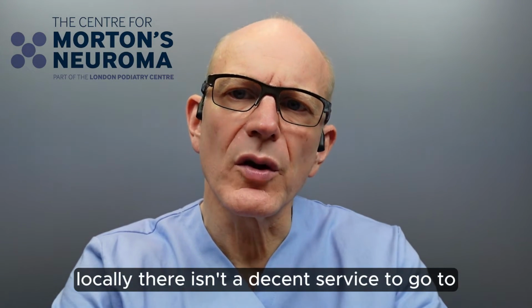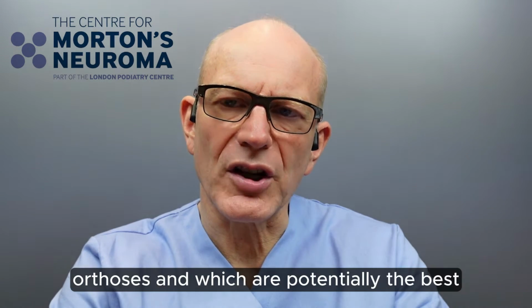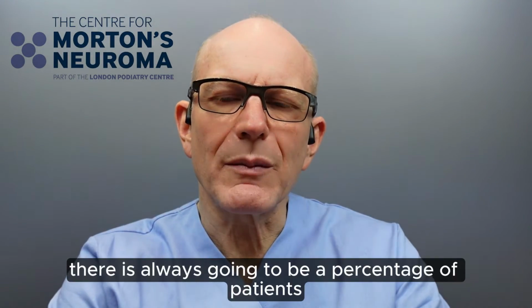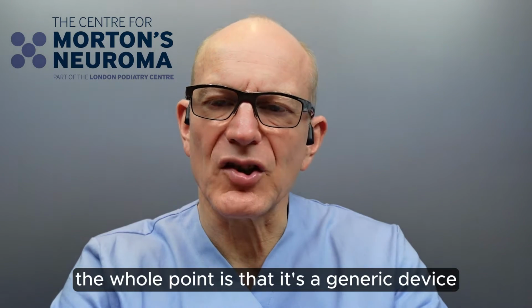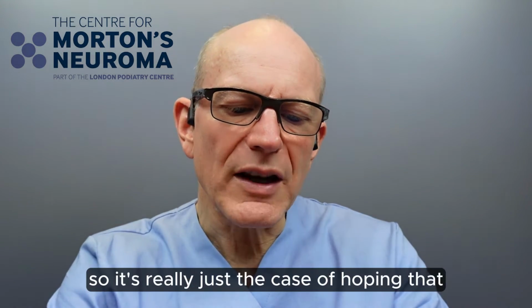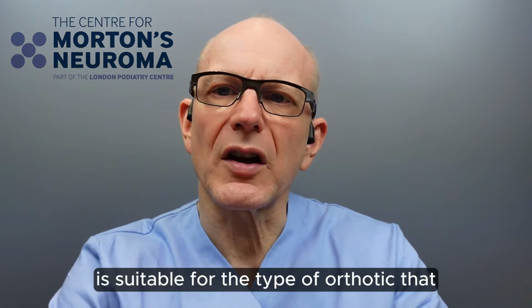However, for some patients, for various reasons, perhaps because of financial restrictions, or perhaps because locally there isn't a decent service to go to, patients do ask a lot about off-the-shelf orthoses, and which are potentially the best. The caveat to that is that there is always going to be a percentage of patients who are not going to be suitable for a specific type of off-the-shelf orthotic.